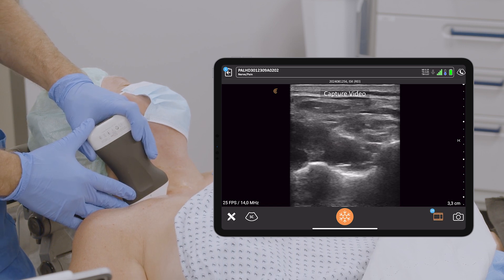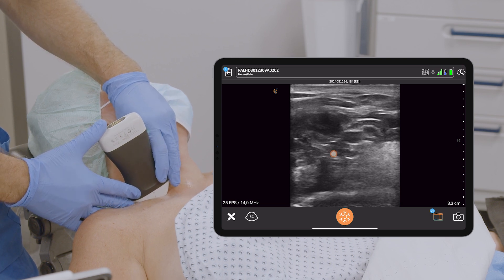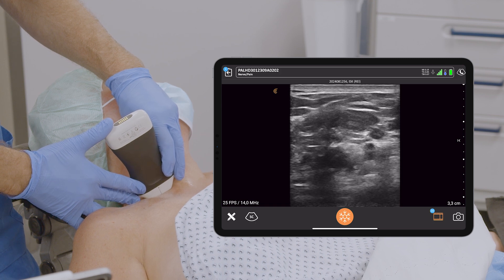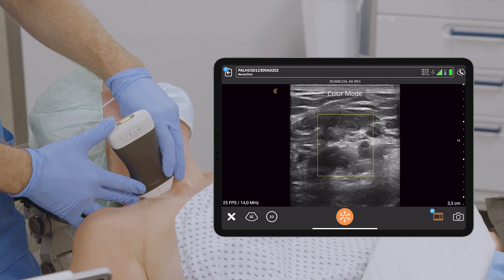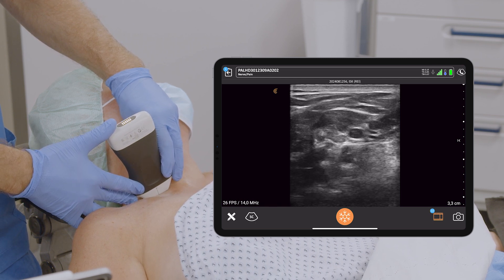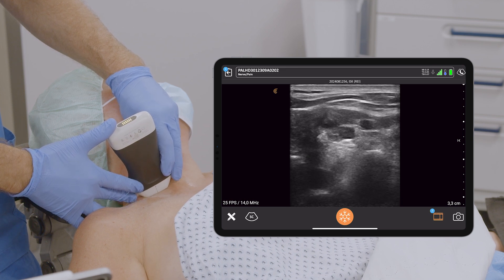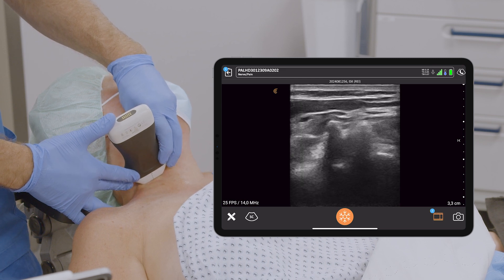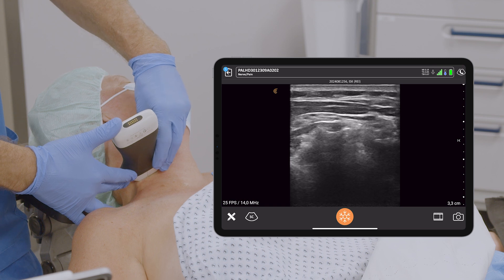Capture video. And now I go up and follow the brachial plexus into the interscalene groove. Sometimes there are some vessels — the vertebral vessels are right in the center of the image right now. Color mode — here they are. B-Mode. And I've got the C7 spinal nerve in the transverse process. This is C6, and this is C5, and ultimately this is C4.